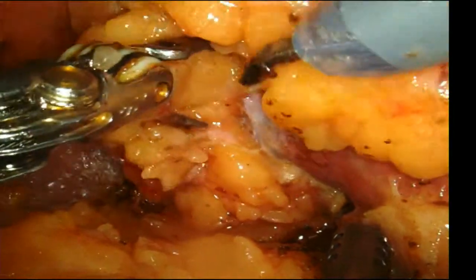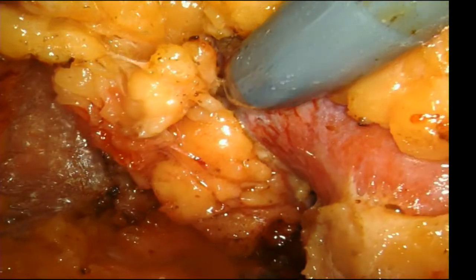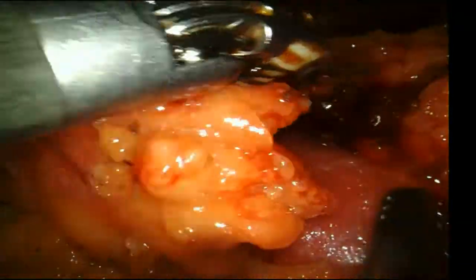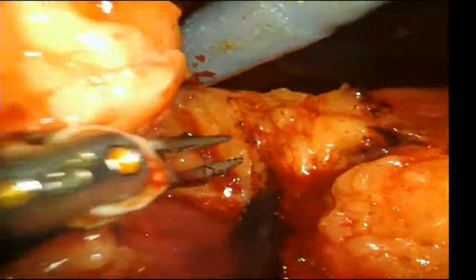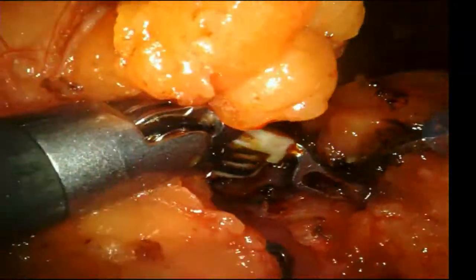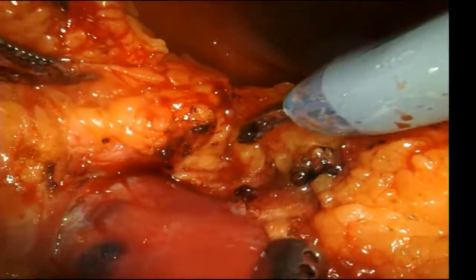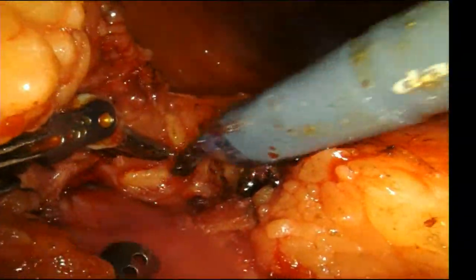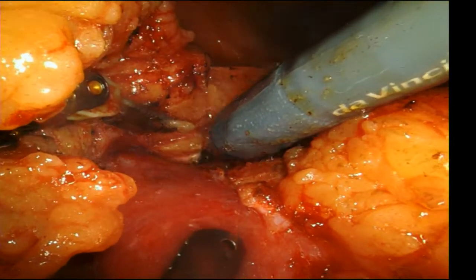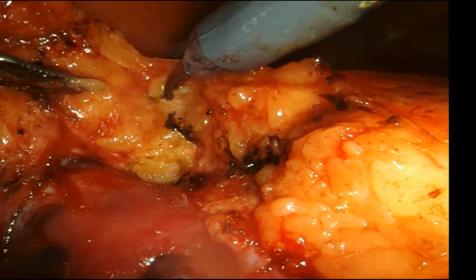I'm similar to you. I just have my sutures. Sometimes if it's a big tumor, I'll just make sure I have an extra V-Loc, just in case I need to put more sutures in for the inner repair. I usually do make a bolster just in case. I don't usually use the bolster for reconstruction, but I will have it sometimes when it's bleeding. When I'm switching my instruments out to the needle drivers, I'll use it to push on the defect while we're switching, but nothing else. No rescue stitches or anything else.